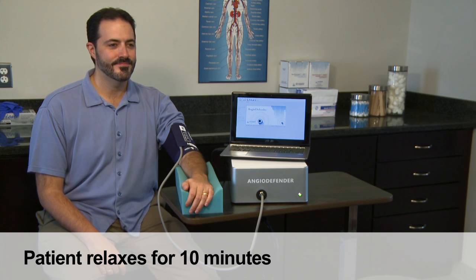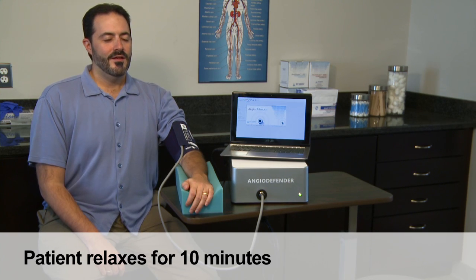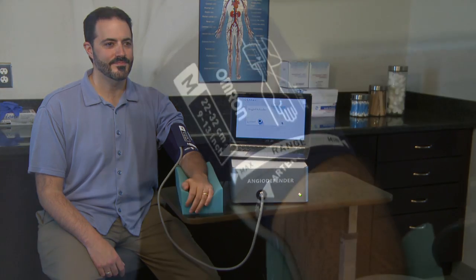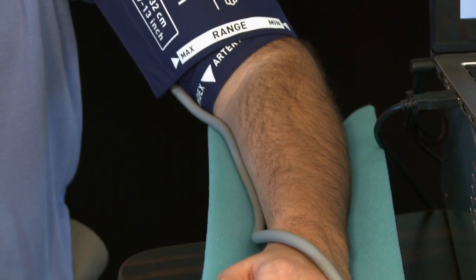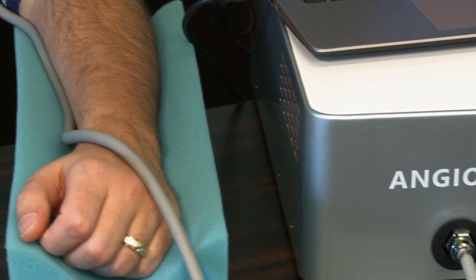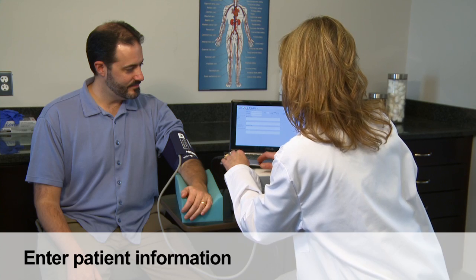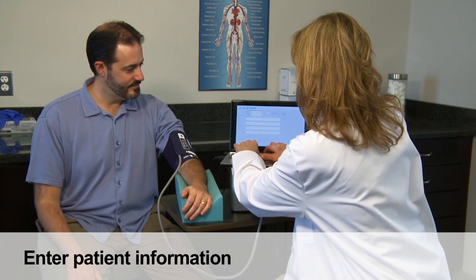The patient is instructed to remain relaxed and motionless for the duration of the test. In particular, the patient should not move the arm that the cuff is on and should remain still and quiet during the rest period and during the active testing. While the patient is resting, patient information can be entered into the AngioDefender system.